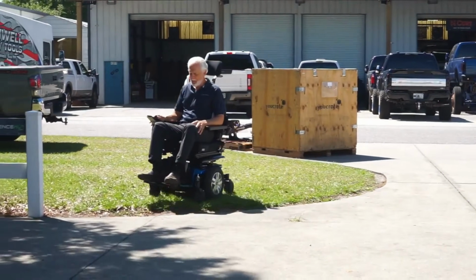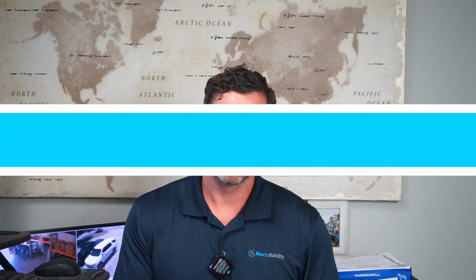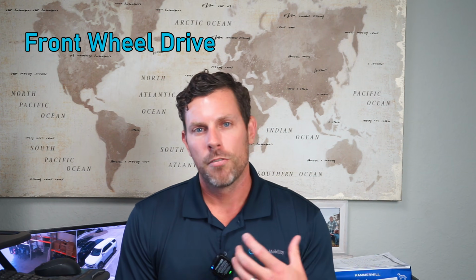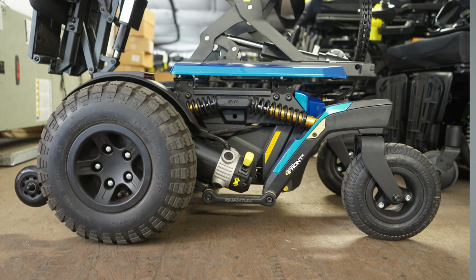It is going to be primarily hard top surfaces and for inside usage. The next drive configuration that we're going to go over is your front wheel driven units. Front wheel driven units mean your large, typically 14-inch drive tire on these units is going to be located towards the front of the unit, almost underneath your thighs when you're sitting on the chair.